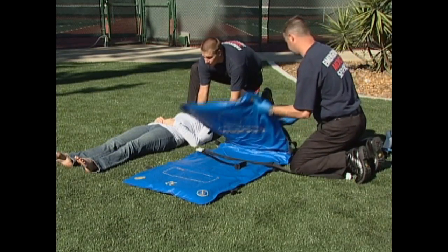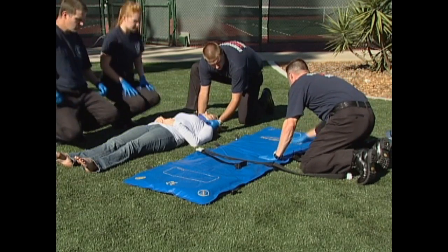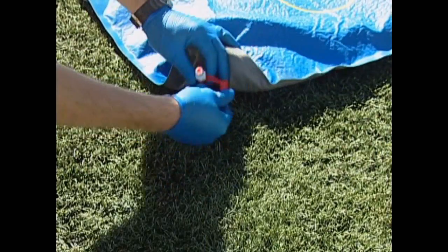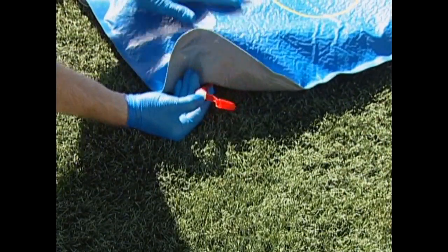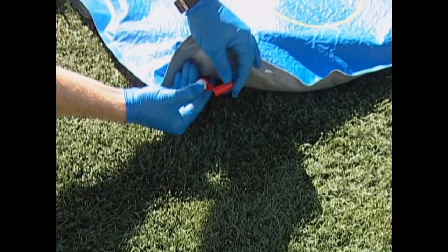Lay the Evacusplint mattress out on a flat surface near the patient. The Head and Shoulders logo indicates the head end of the mattress. Remove the red vinyl leashed cap from the valve. Release any vacuum in the mattress by pushing in the red valve stem, and keep the valve stem pushed in until the mattress is pliable.